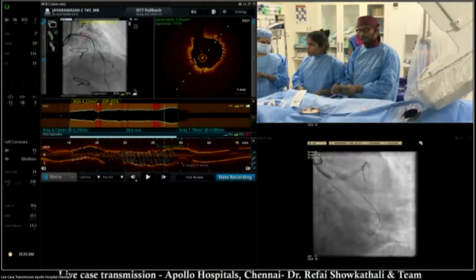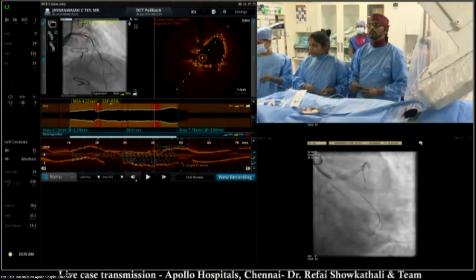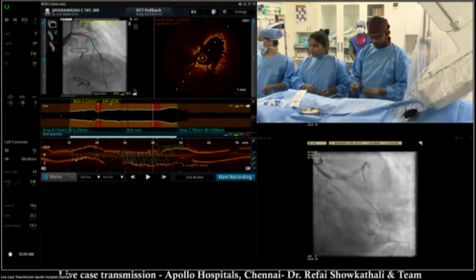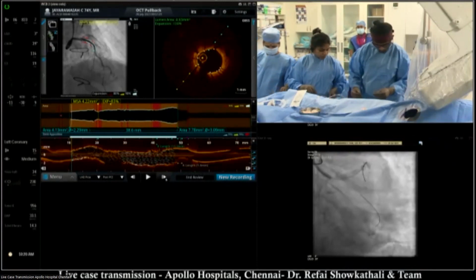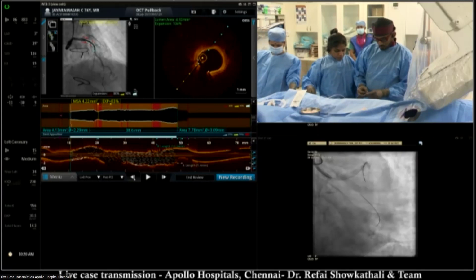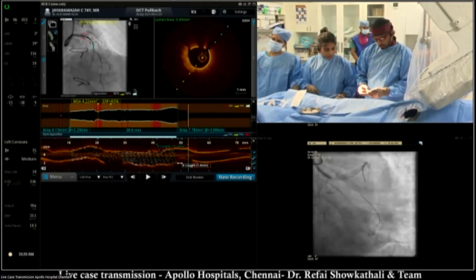The next question for you, the panel, the distal stent is only 4.5 or 4.75 minimal stent area. What do you think? That is okay. My only point is about the length of the dissection, and it's actually an edge dissection extending to the media, not into the intima. So what is the length of that area, whether it requires a stent now?